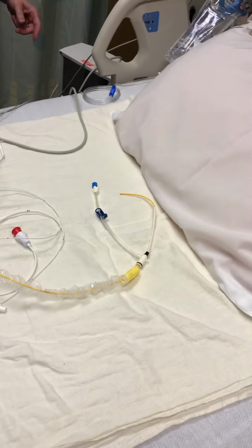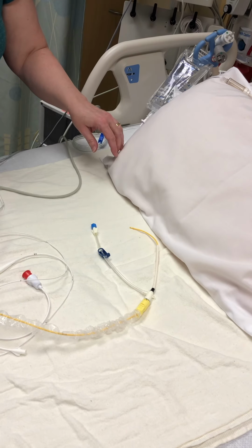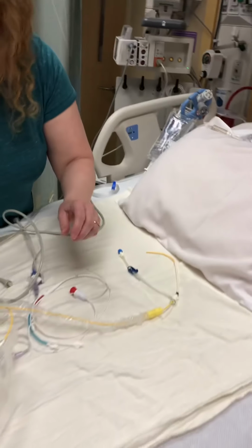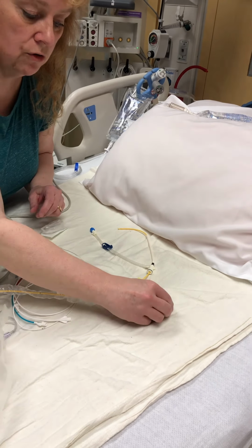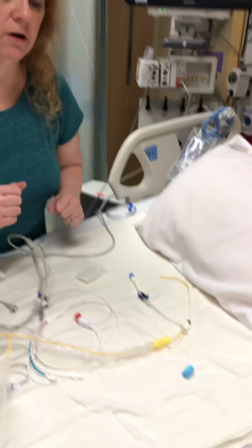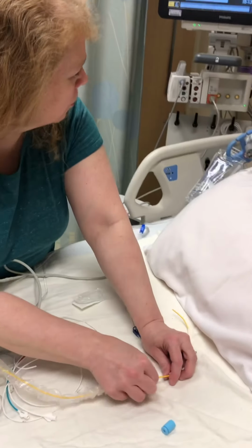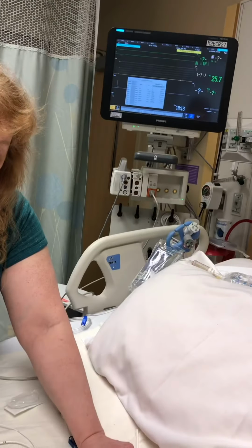And when you pull the swan, you're going to do a fluid, steady motion when you pull it. So you're going to tell the patient to take a nice deep breath. You're going to do it sterilely. You're going to have sterile gloves on, and this is going to be sterile also. It's going to be on your sterile field. So you're going to tell the patient, take a nice deep breath in and hold it while you're pulling it. And then you're going to look up at your monitor to make sure there's no ectopy.